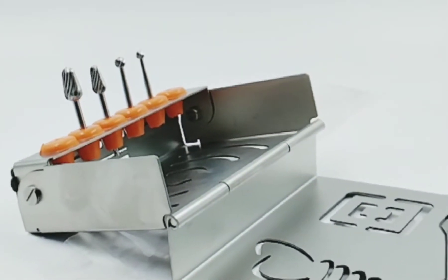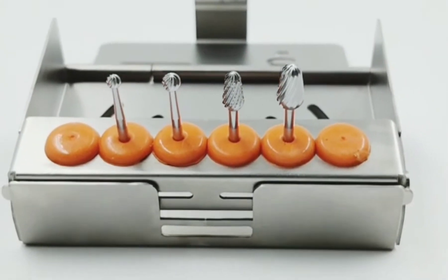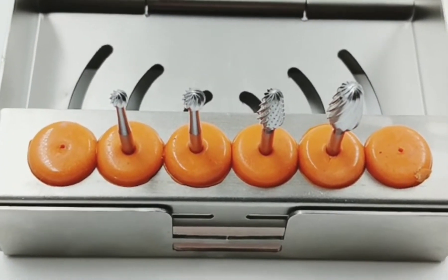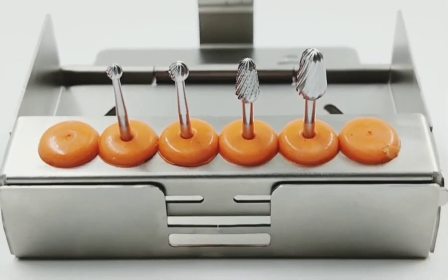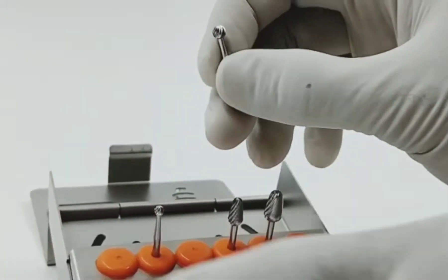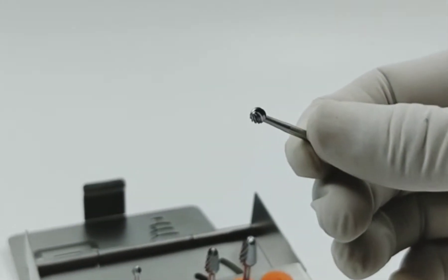The Ridge Contouring Bone Burr is for contouring and reshaping bone anatomy, making ditches during ridge splitting cases. Dentists can build perfect ridge shapes with ease, and it can be used to widen maxillary sinus windows.